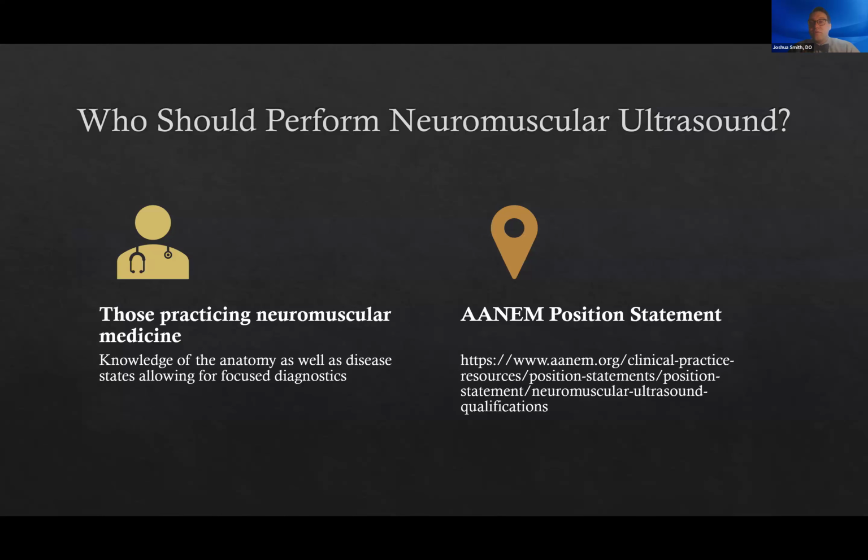And you say, well, who should be performing neuromuscular ultrasound? In my opinion, it should be those practicing neuromuscular or electrodiagnostic medicine. Neuromuscular ultrasound a lot of times is like a point of care ultrasound, which is a growing field in medicine. Ultrasound is not just in the radiology labs now, especially if you look at emergency medicine, even family medicine, having point of care ultrasounds. Even some universities like Temple provide those Butterfly ultrasounds to their graduating classes. So being able to have this kind of non-invasive testing is growing.